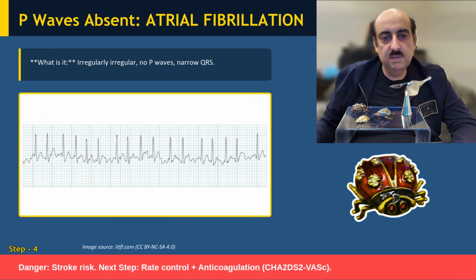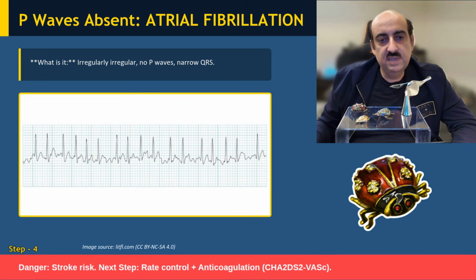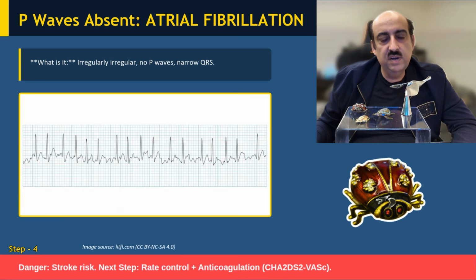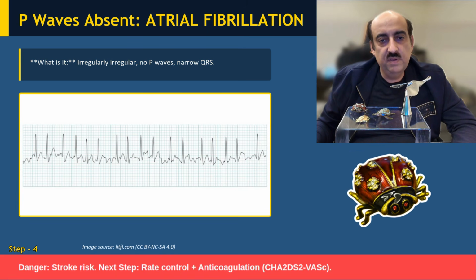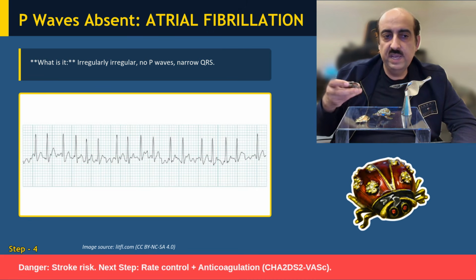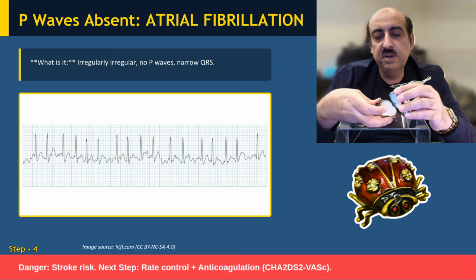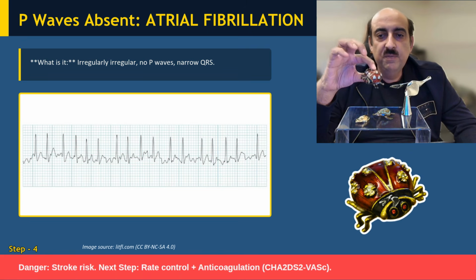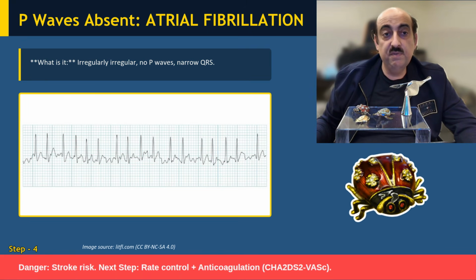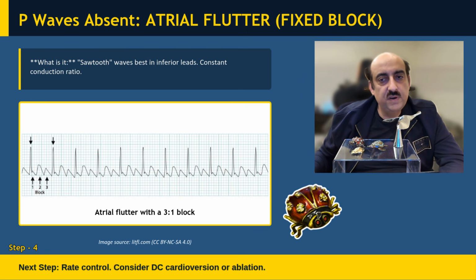Looking at a classic example, this is an ECG trace from Life in the Fast Lane. You can see the baseline undulation, fibrillatory waves or F waves, and the RR intervals are variable, and there are no obvious P waves and a narrow QRS complex. So I've used our techie beetle for this particular reason. Techie is from tachycardia, red beetle or burgundy beetle, to signify the importance of fast atrial fibrillation and the rapid ventricular response.